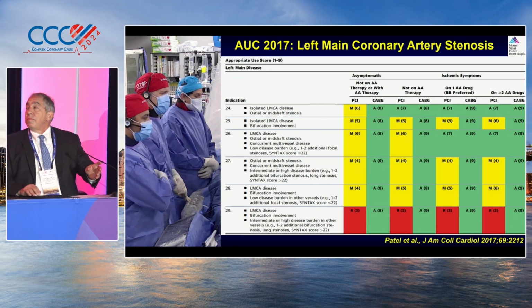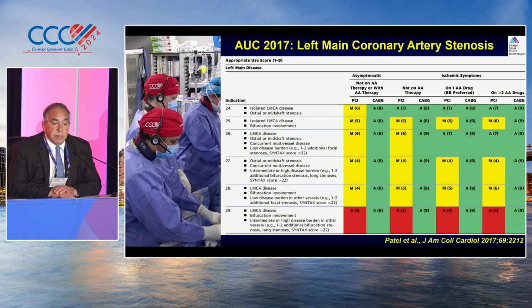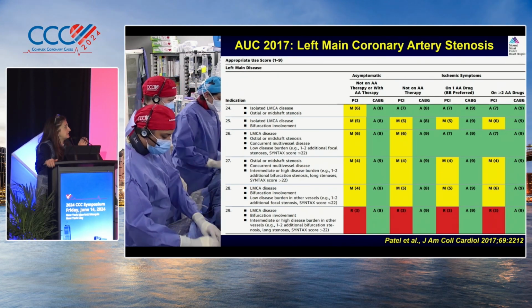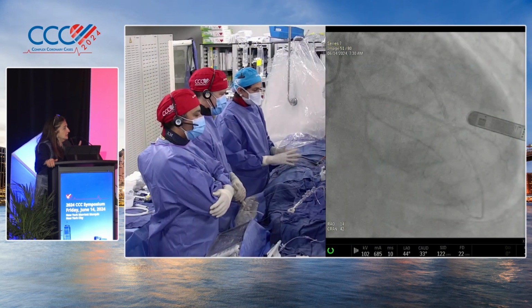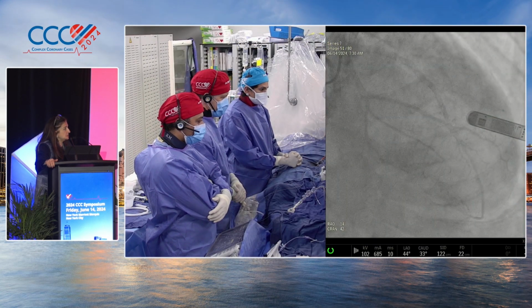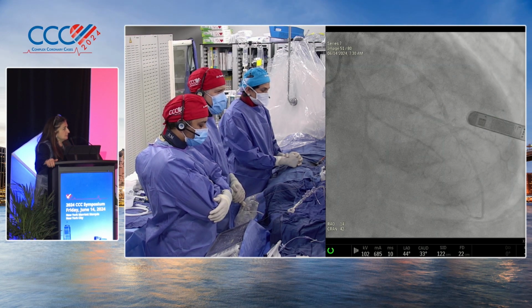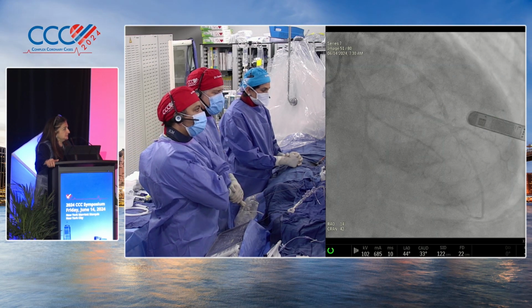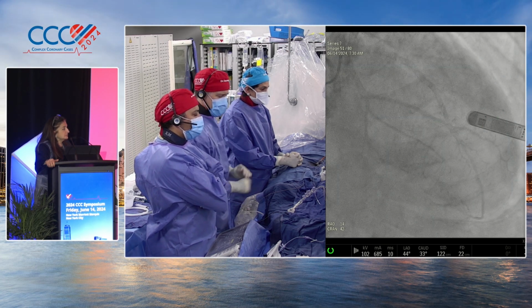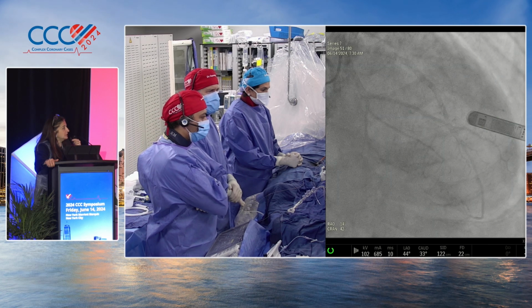The other part is the question of a support device in a case like this, with such high PA pressure and right-sided pressures. Yeah, I wouldn't disagree with that. I asked it as a counter argument: the straightforwardness of the ostial circumflex and the LAD is such that your ischemic times would be relatively low. All right, well, that's interesting.